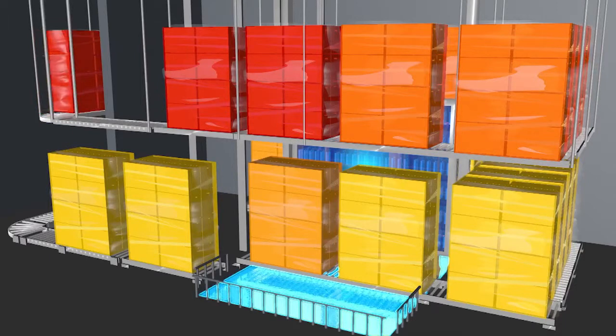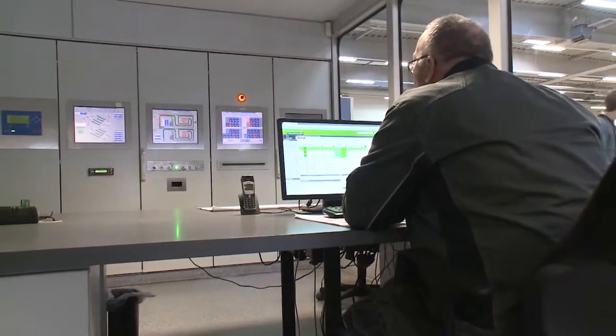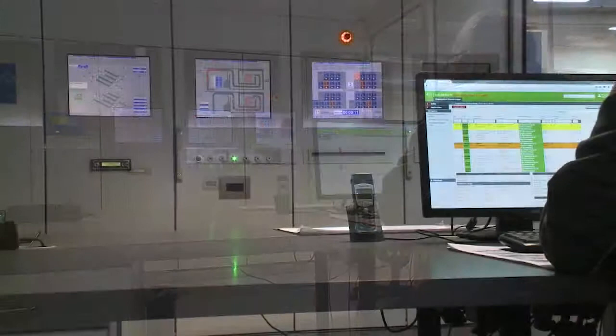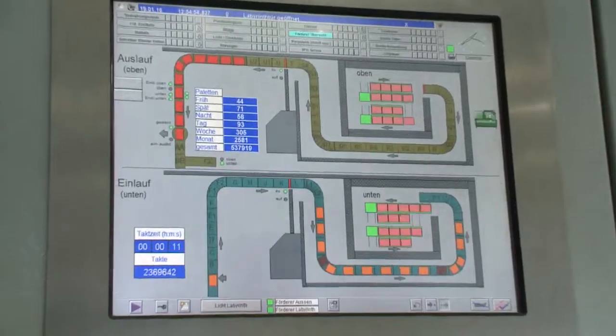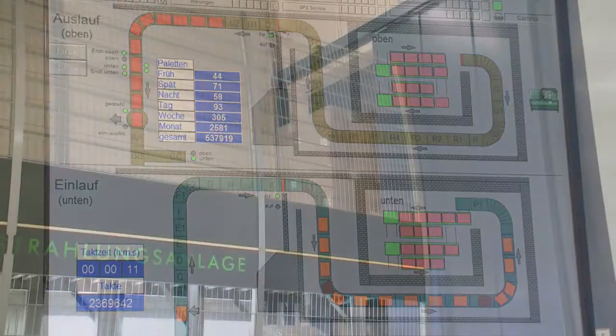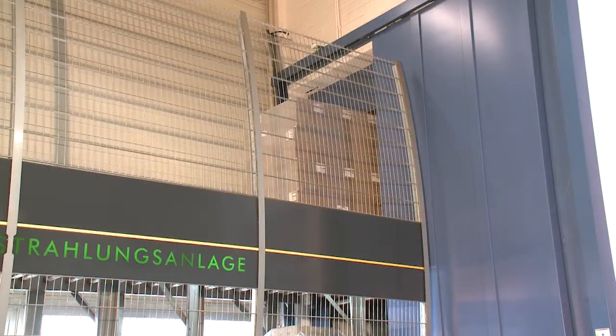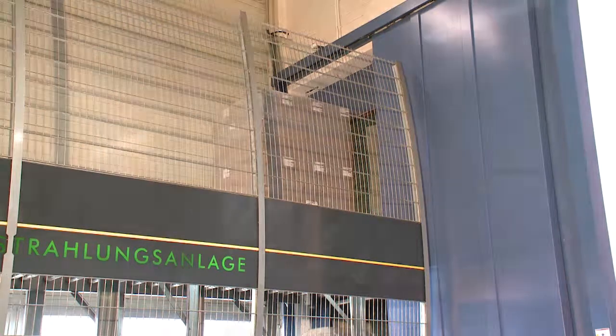The irradiation rhythm of every single pallet in the gamma facility is automatically controlled. The sophisticated plant logistics with two transport levels allows to achieve the correct radiation dose for each and every pallet individually.